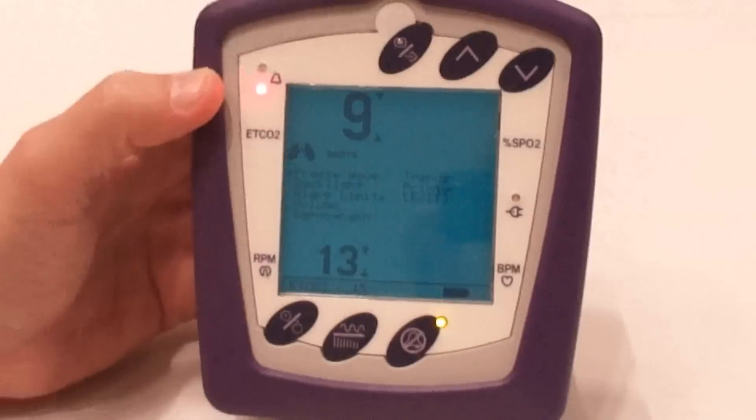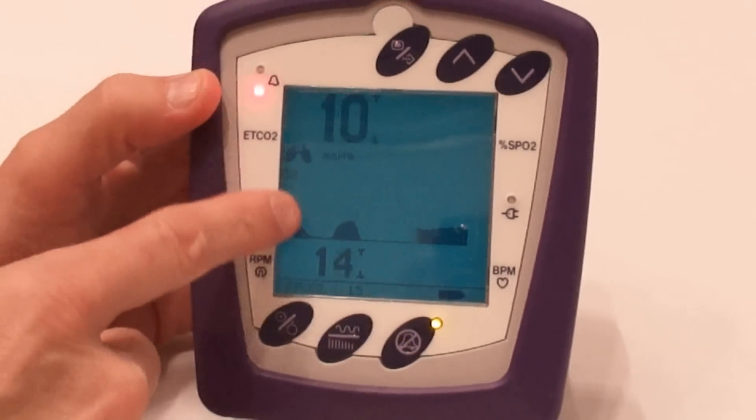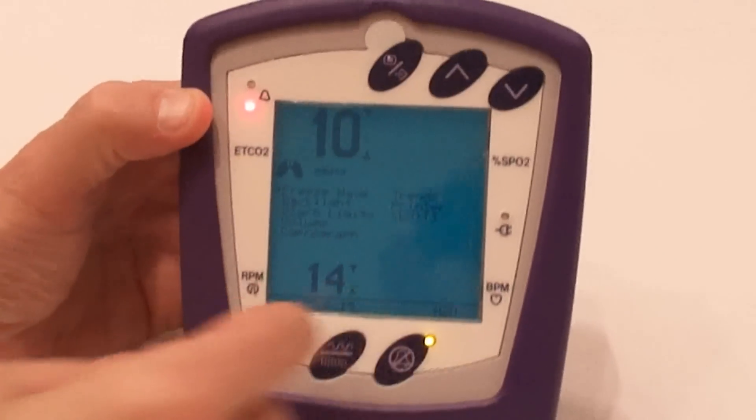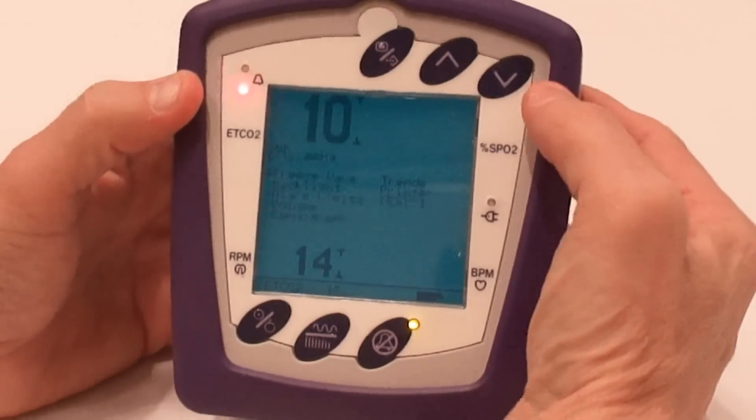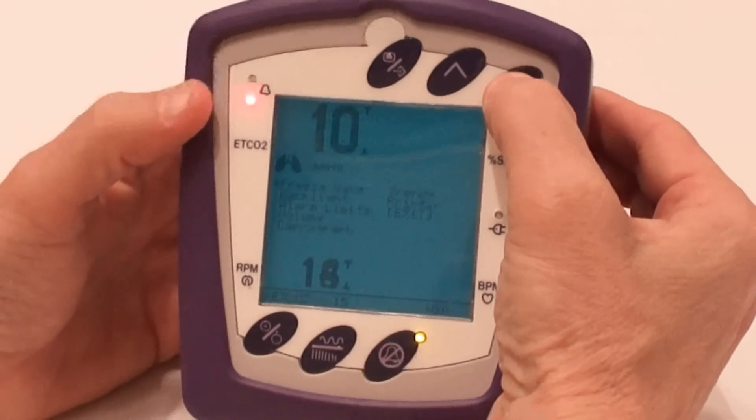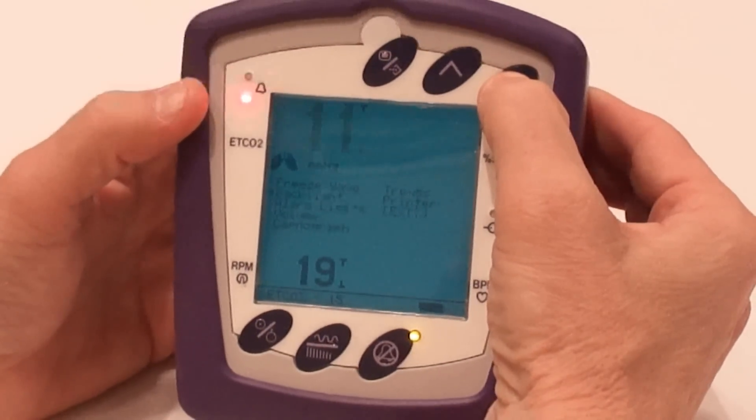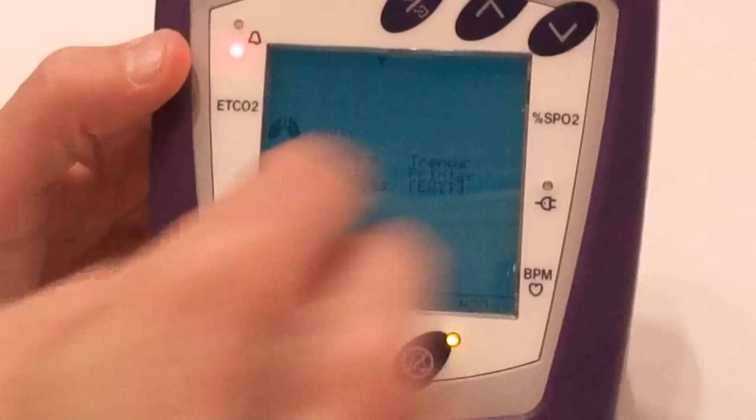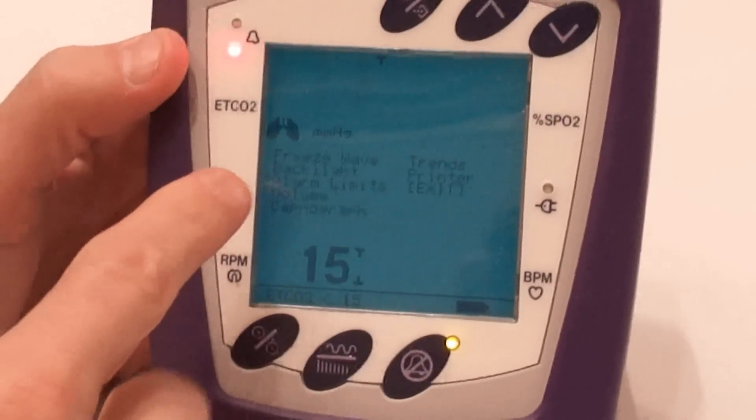That silences your alarms. Now from the menu screen there, you can adjust and go to your backlight. You can adjust the backlight of it, the contrast. You can also control the alarm limits. Okay.